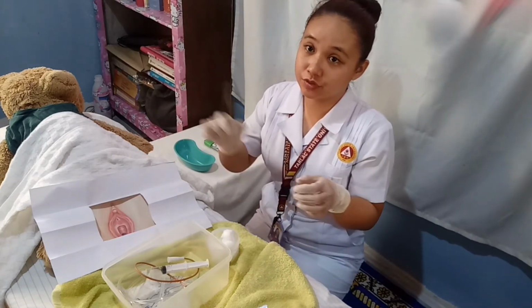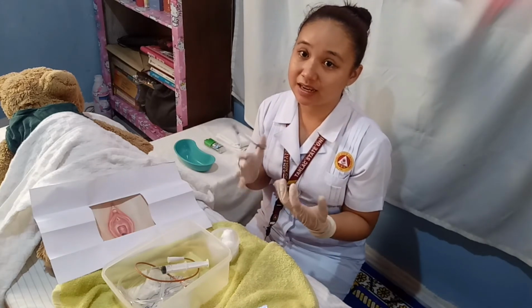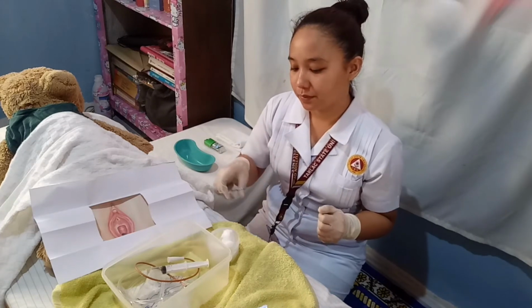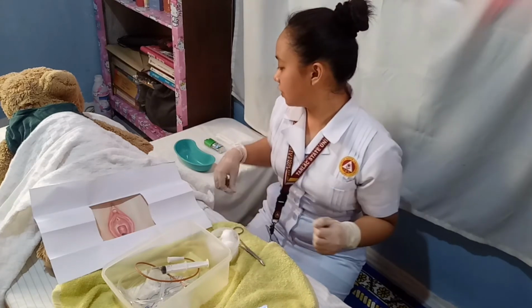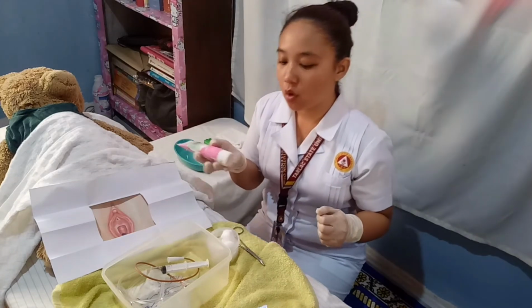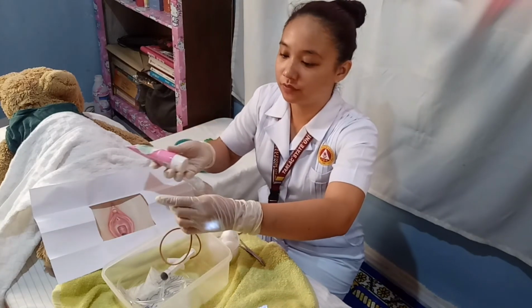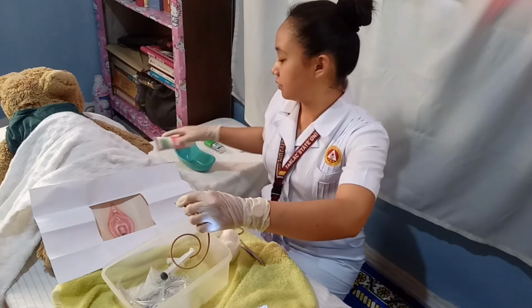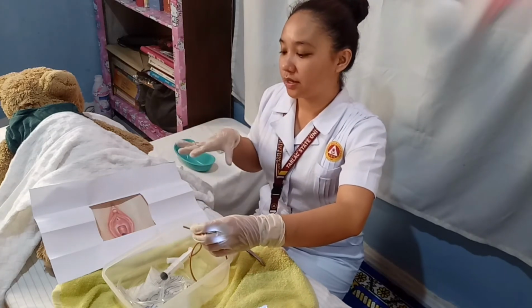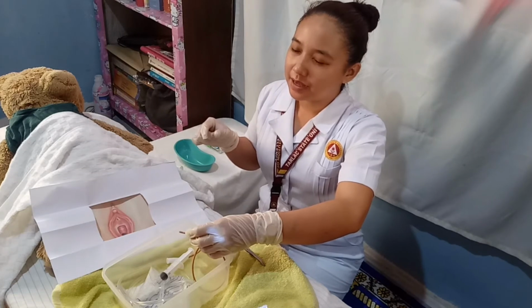Then you need to open the specimen container if the specimen is to be drained, and then you need to lubricate 1 to 2 inches of the catheter tip. So let's say this is the lubricant, so we are going to put it on 1 to 2 inches of the catheter. So there you go.